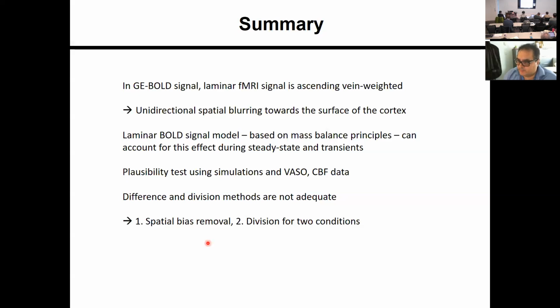Yeah, it means that obviously if you have unreliable data in the lower layers, then I would not use the method, because you want to solve problems and not amplify problems. So if you use these methods where you say we don't know whether the lower layer signal was 1% or 5%, then I would say you would perhaps do more damage than reduce the spatial bias.